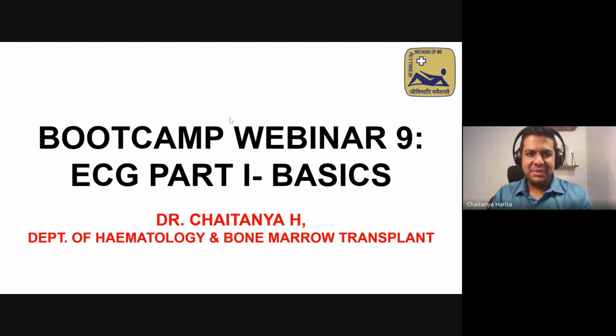Welcome to webinar number 9. So I think Namita and I discussed this and we decided that we'll split the ECG into two parts. I thought I'd do part 1, which is how to read an ECG, and then part 2 would be to discuss certain common ECGs that all of you would encounter at some point of time in your rural practice and then your practice henceforth.